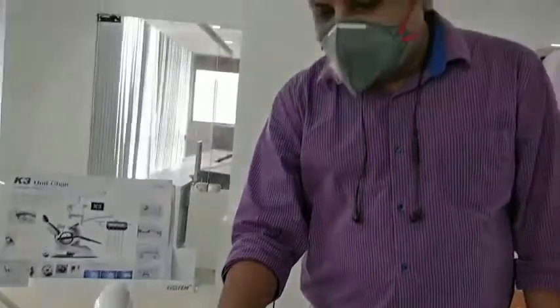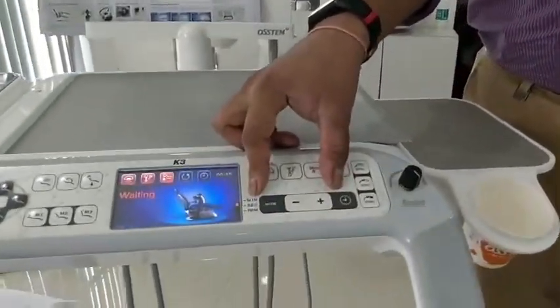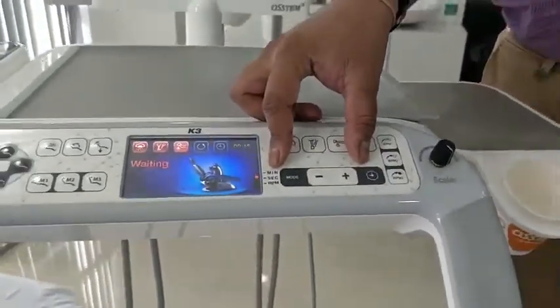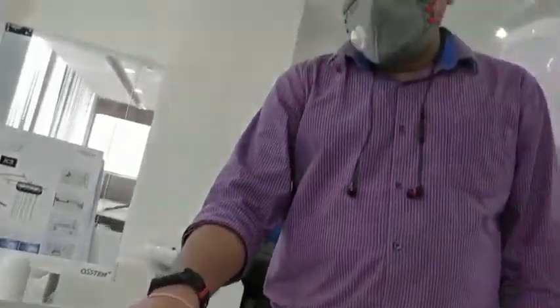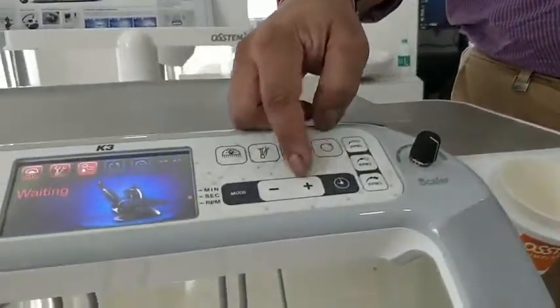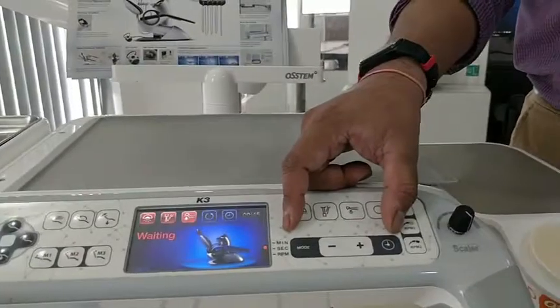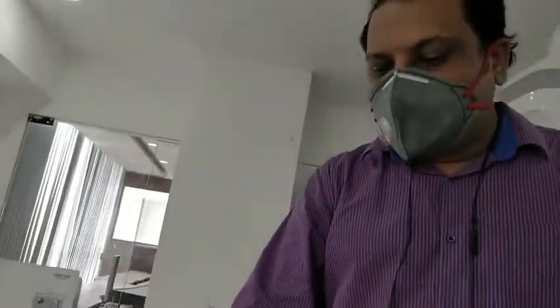For procedures like composite restorations, GIC restorations, laminates, or veneers — where you need to wait while sticking laminates to the patient's teeth — there is a timer button to set a timer for the job, especially useful when doing light curing for composite restorations.